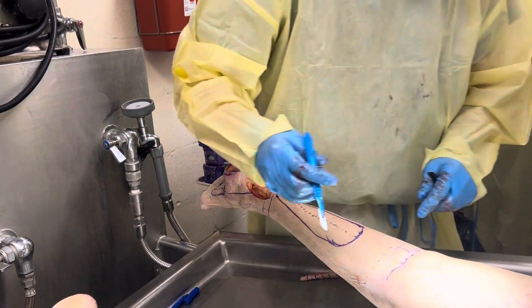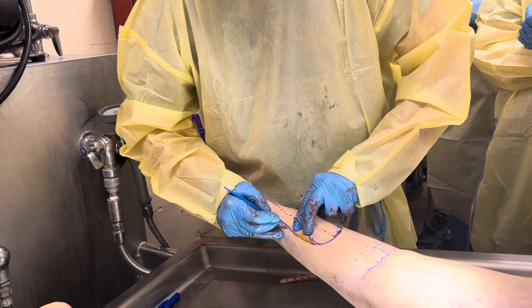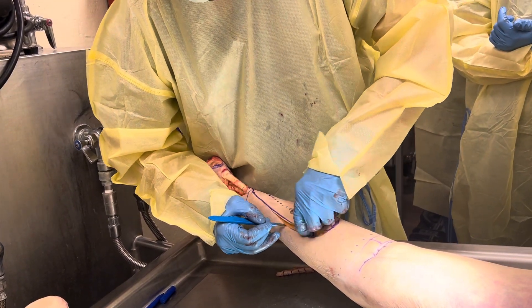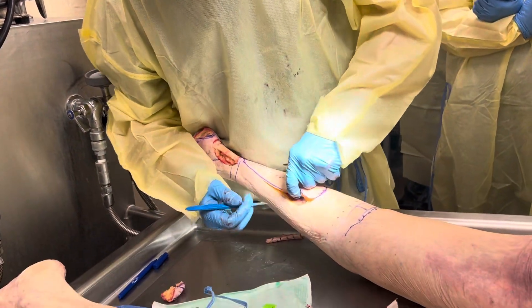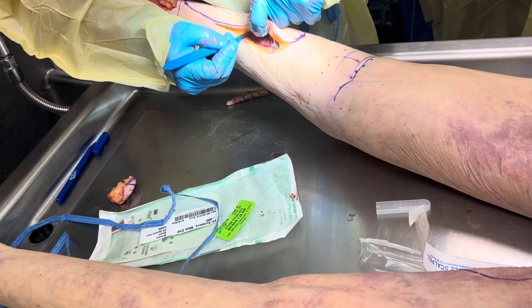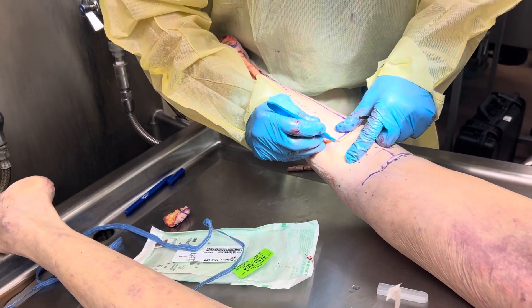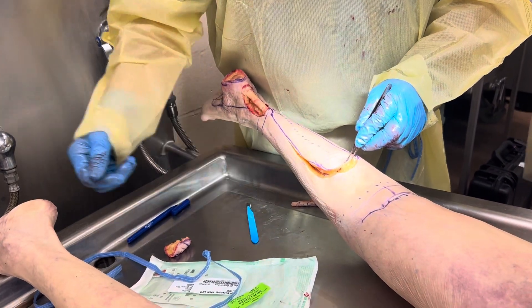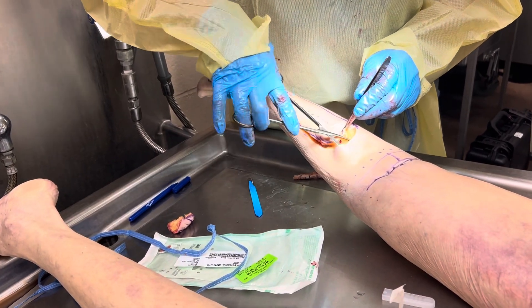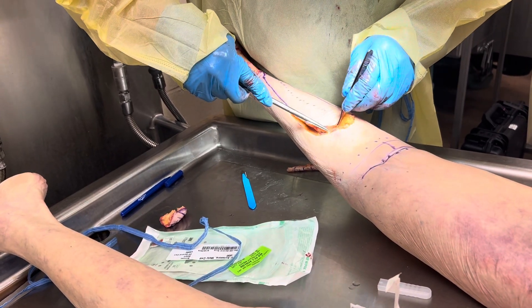It's a very easy dissection. You can start wherever you choose to — I choose to start here on the medial side. I come down. This is all free lunch, so to speak. You want to get down to the fascia. Here's your fascial layer — you want to be right here. You want the gastrocnemius muscle down. I come up here and do the top. When I come in, I look for the short saphenous vein in case I need it to supercharge it later or exteriorize it.